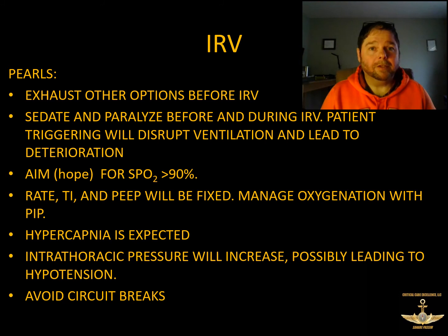Really look at a blood gas before you get started, and see if you've got room for the CO2 to go up that high. And if you don't, then again, you want to get on the phone with medical control, or get on the phone with the supervisor, tell them where you are, and that maybe you can't do this.